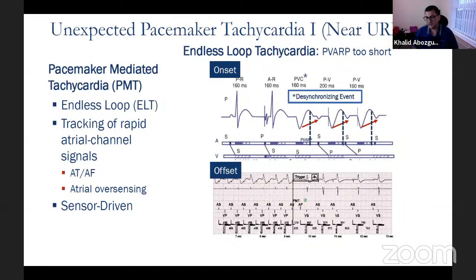However, if you think the degree of LV impairment is disproportionate to the involved artery and you don't think revascularization will improve the LV function, and definitely you think that you will be pacing more than 40%, then we tend to have a very low threshold for putting a CRT-D device in. But all of these cases have to go to an MDT, and no one knows the answer. It's so complex, and this is why it involves more than one physician to make a decision, obviously with discussion with the patient. So that's my take.